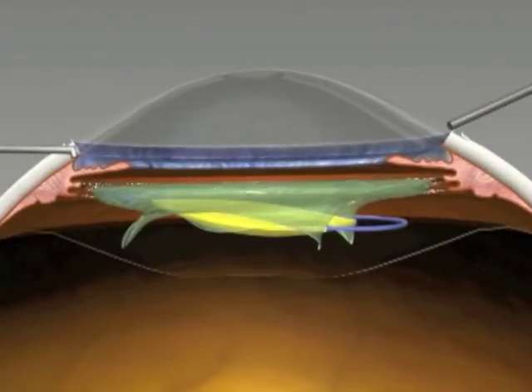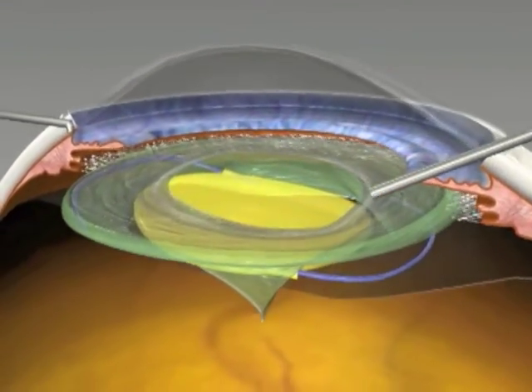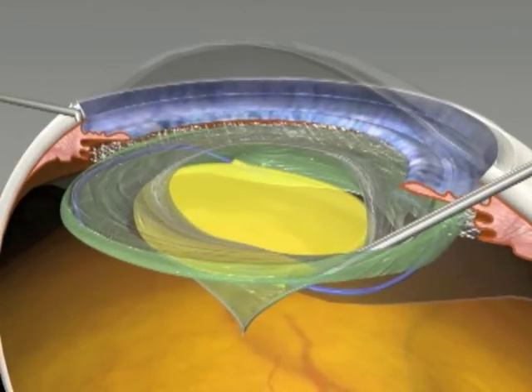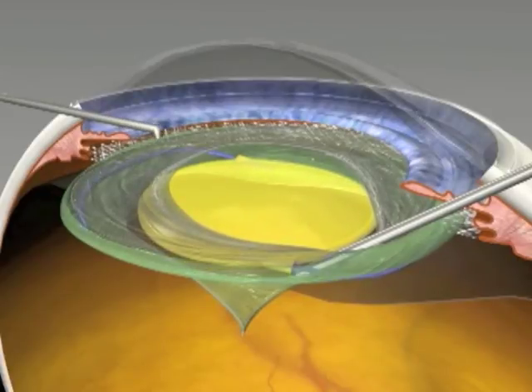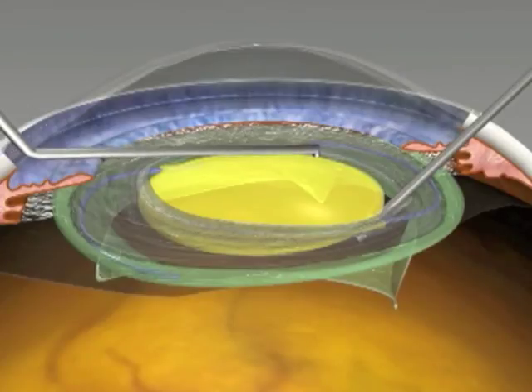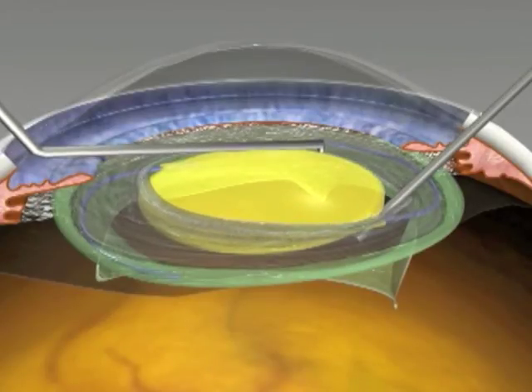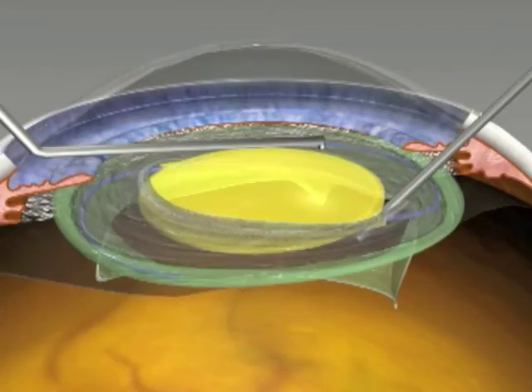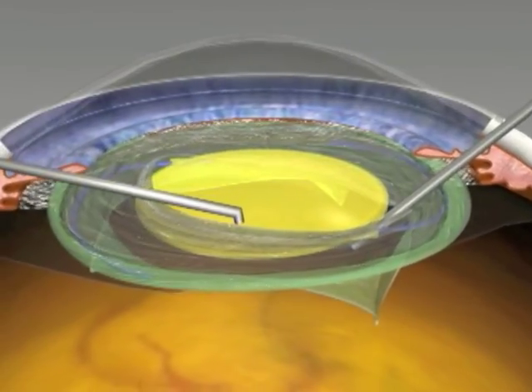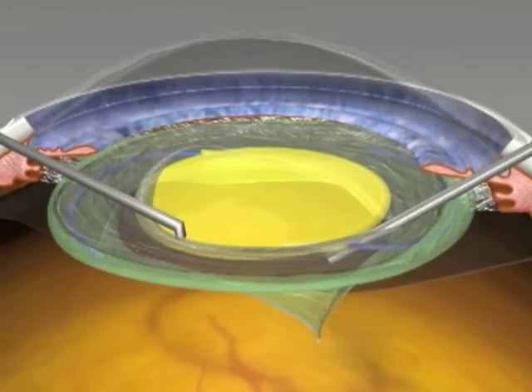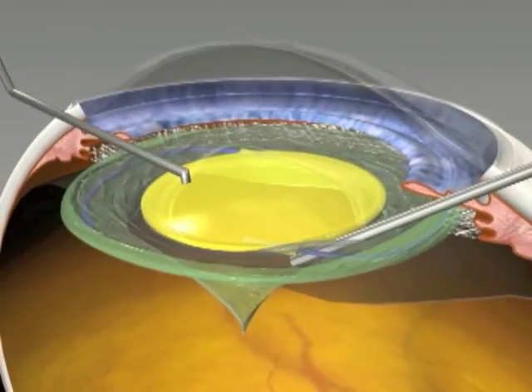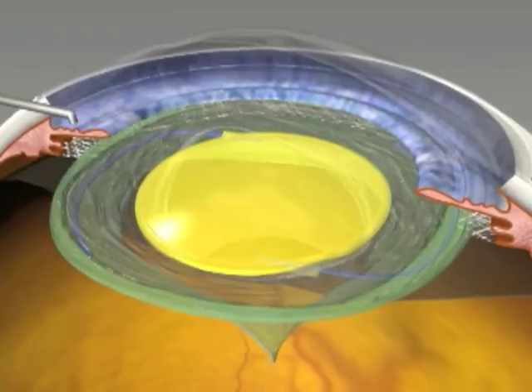This case illustrates a patient referred to me a few days after surgery where the surgeon thought that the lens would be stable in the bag in spite of a posterior capsule tear. But the tear extended and the lens started to go into the vitreous. So I was able to just lift the optic up through the anterior capsule rexus, which fortunately was smaller than the optic, and achieve capsule fixation. No vitreous presented.